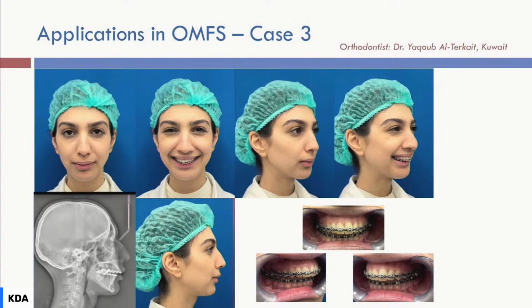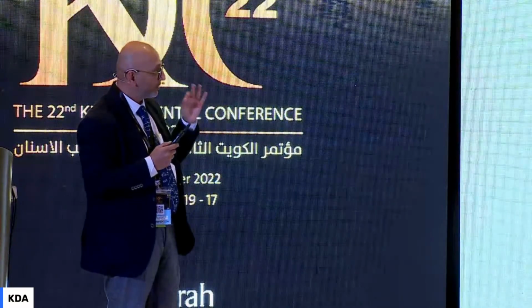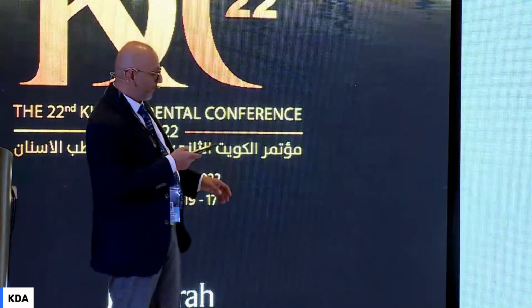Here, this is another patient, class 2 deformity. Again, we are gonna do mandibular advancement. For every single case, I use the same protocol. I don't switch between normal protocol to advanced protocol. So every single patient received the same full digital workup. Everything is planned from 3D facial scanning. The patient comes in, CBCT, 3D facial scanning, conventional photos, intraoral scanning, clinical exam, and we're done. We target that to be done within 90 minutes.